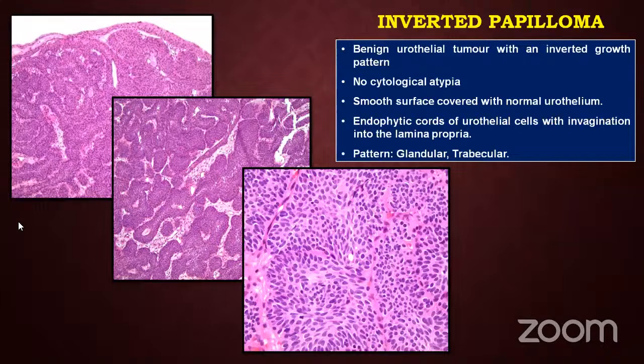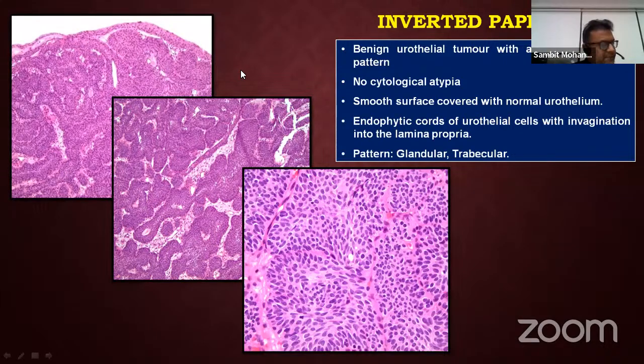Then this is an inverted papilloma. Who is going to describe this lesion? I have already said that in the group. One of the trainees.